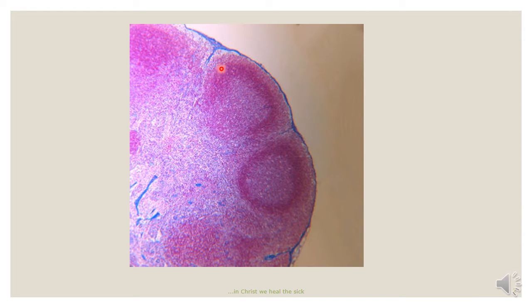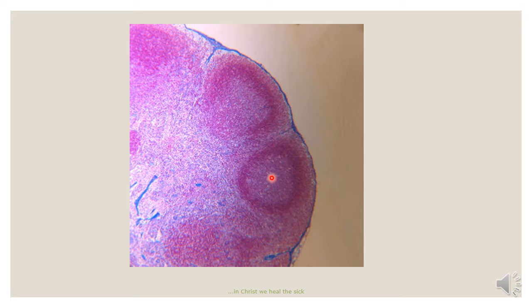The cortex is made up of numerous cell aggregates, and these cellular aggregates are called the follicles. These follicles have two forms: you have the primary follicle, and then the secondary follicle, the secondary follicle having a pale center, while the primary follicle has no pale center.